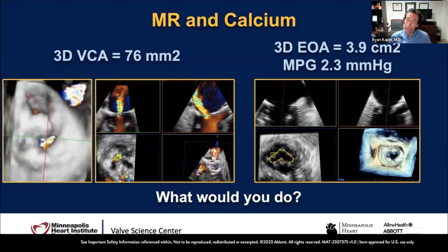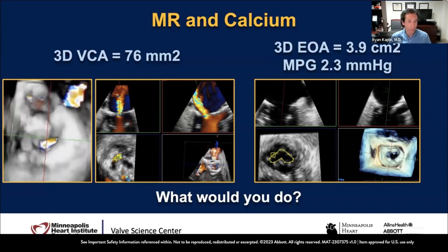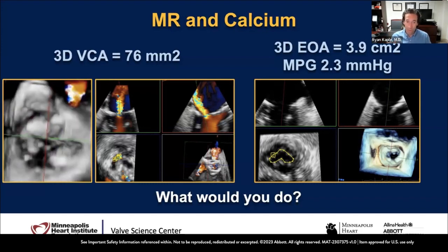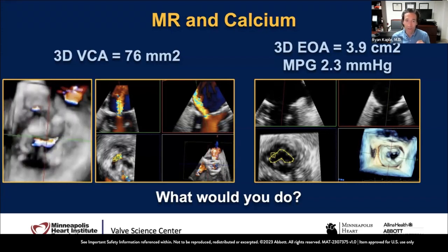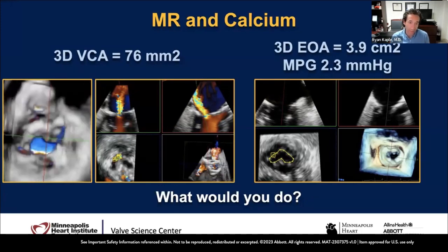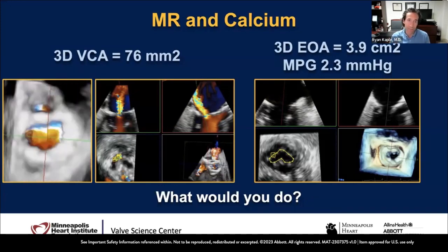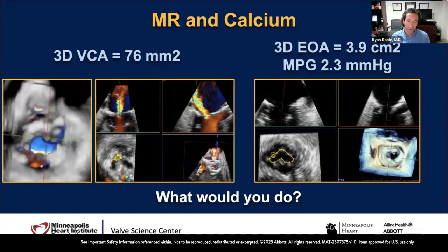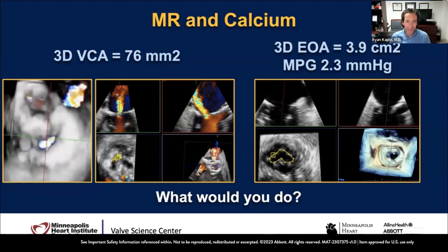And also we do occasionally see leaflet perforations. It's rare, but it does happen in these folks, in the older population with smaller hearts, and where there's calcium at the really where you're going to be grasping, specifically at the edge of the arm, at the tip of the arm, where the most pressure is going to be on the leaflets. And so I'm already thinking about those things.